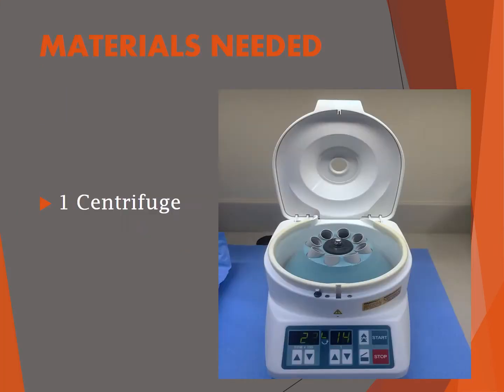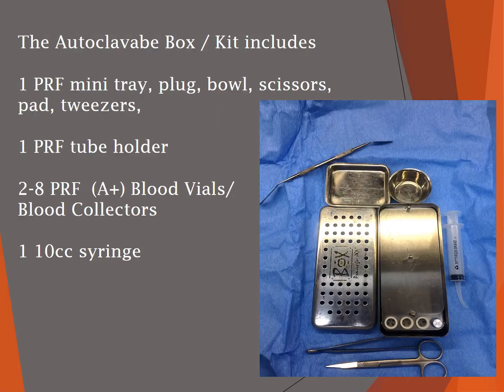This is what the centrifuge looks like with the hood up. You're going to need some materials: an autoclavable box along with a kit. The kit includes a mini tray, a plug, a bowl, a pair of scissors, a pad, and some tweezers. You'll also need a tube holder, vials of blood, and a 10 cc syringe.